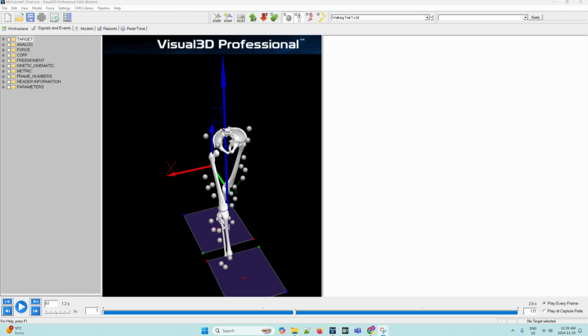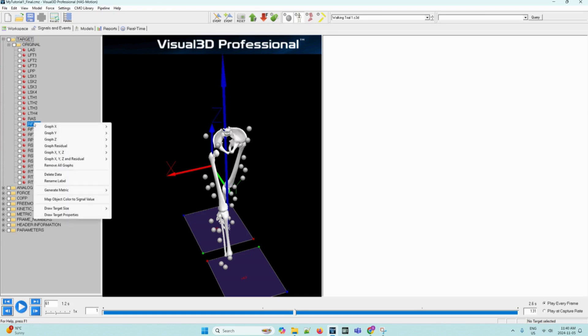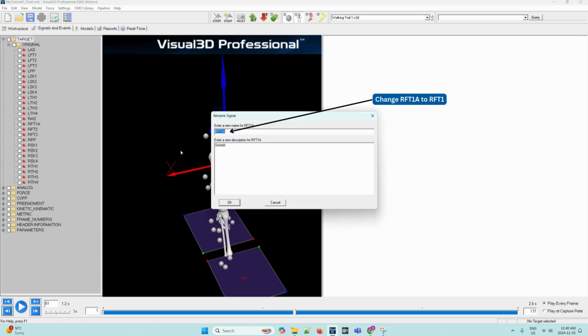On the left side of the screen, there are several folders. We can click the plus sign next to the target folder to open the inner folders. Within the inner folder named original, we can click the plus sign once again in order to reveal the contents of the original C3D data file. The red dots are the original signals as labeled by the capture system. We can right-click RFT1A and select Rename Label to prompt the program to open a dialog box.